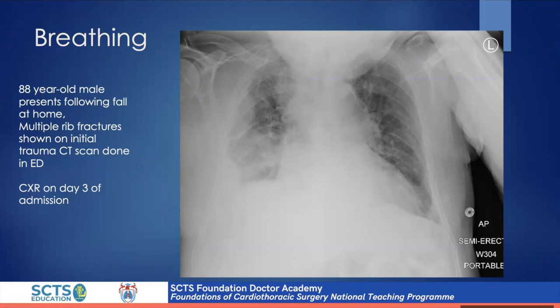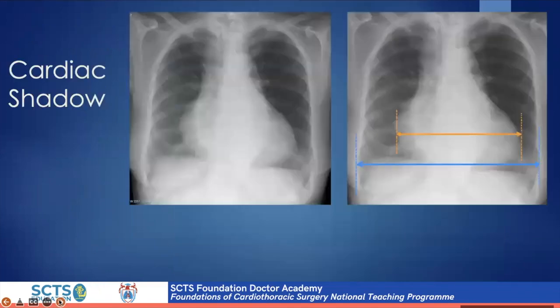It's important to make sure they're able to clear their secretions and start antibiotics soon if you think that they're brewing some sort of infection. Here, he was obviously unable to clear his airways because of the pain as well, and developed a right-sided pneumonia there.